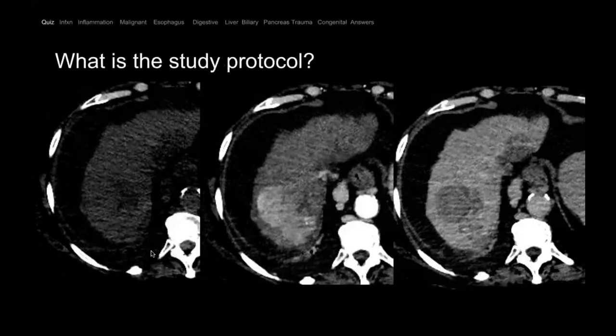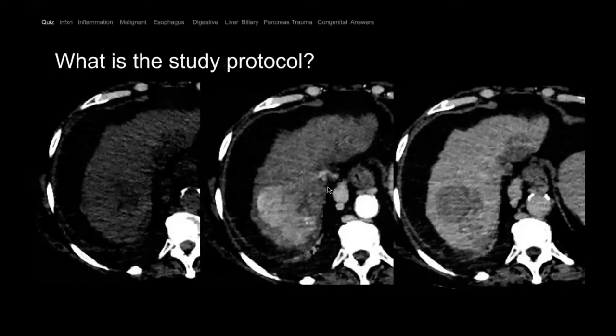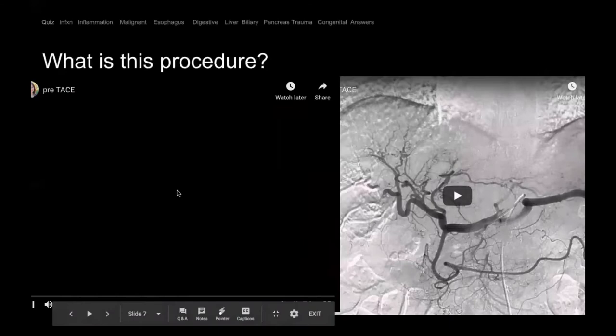This is a CT scan. I'm giving you three different phases. The first phase is dark — that's without contrast. The second phase is enhancing, but only certain things are enhancing. The third phase is hypo-enhancing on the venous phase. So it is with and without IV contrast — you know that because the aorta is bright, but the brightness of the aorta changes.